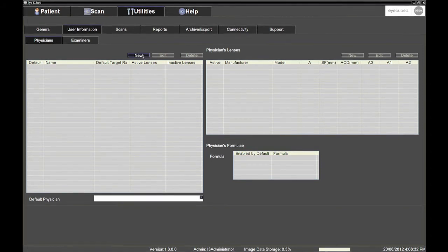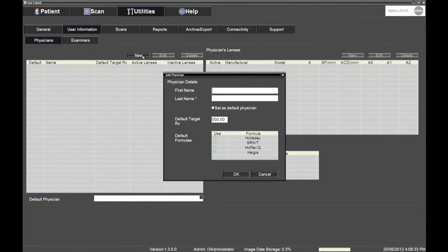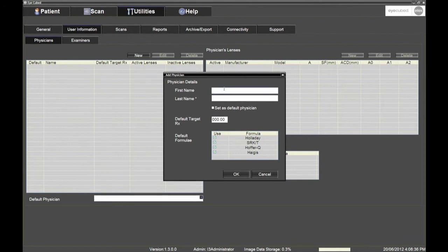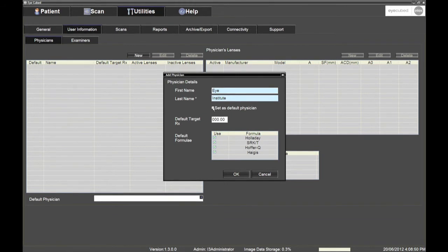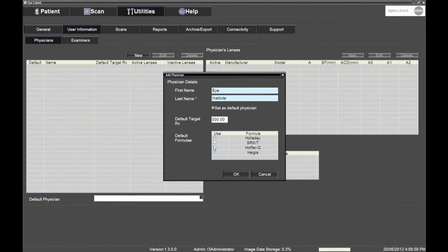To proceed, click New and enter the name of the clinic or hospital. Make sure you tick the Set as Default Physician box and then deselect the formulae that are unlikely to be used in the IOL reports, if any.